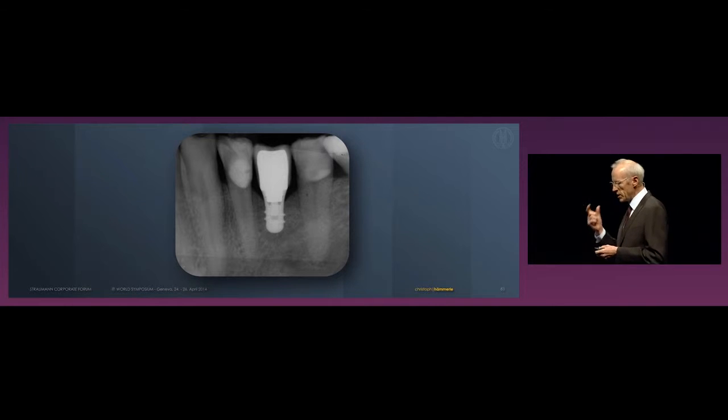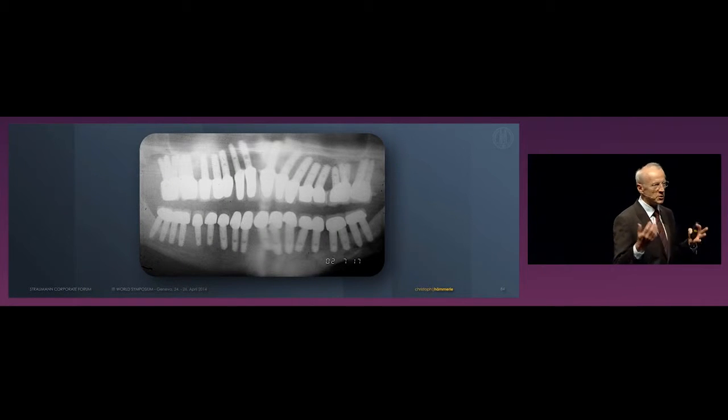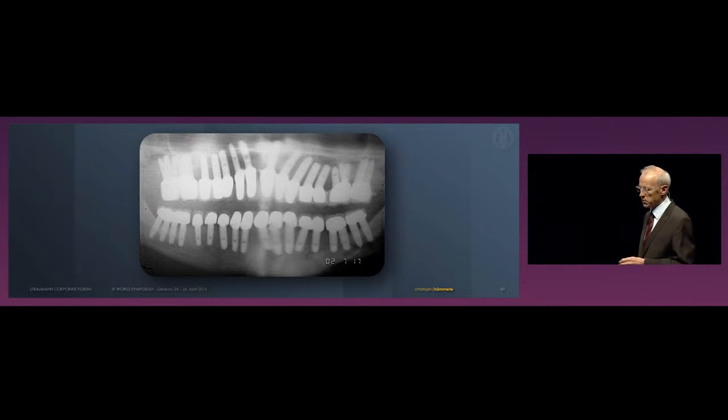Furthermore, well, the implant may be as long as the teeth. This is what it should be. But the teeth are anchored differently in the jawbone than the implants are. So teeth, I think, are not a good reference. What do you think about this image? Now, everybody's kind of amused. I am too. So here we agree this is too much. But how will we know how much is too much, how much is enough, and when it is not enough? This will be the topic of the presentation.